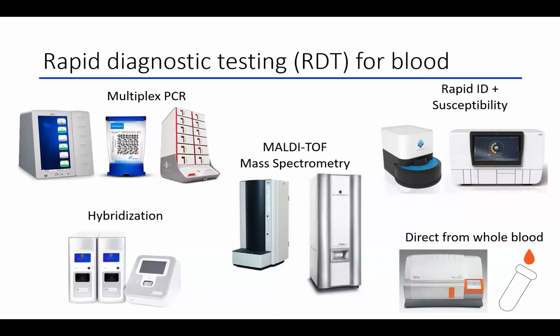And so for a long time, these have been evaluated within the microbiology laboratory, and it's easy for us to pull data from there because we are totally in control of the data we're generating. We implement an assay and we will look at things like, did it give us the correct ID? What was the turnaround time to results? And those are very easy data for us to pull.